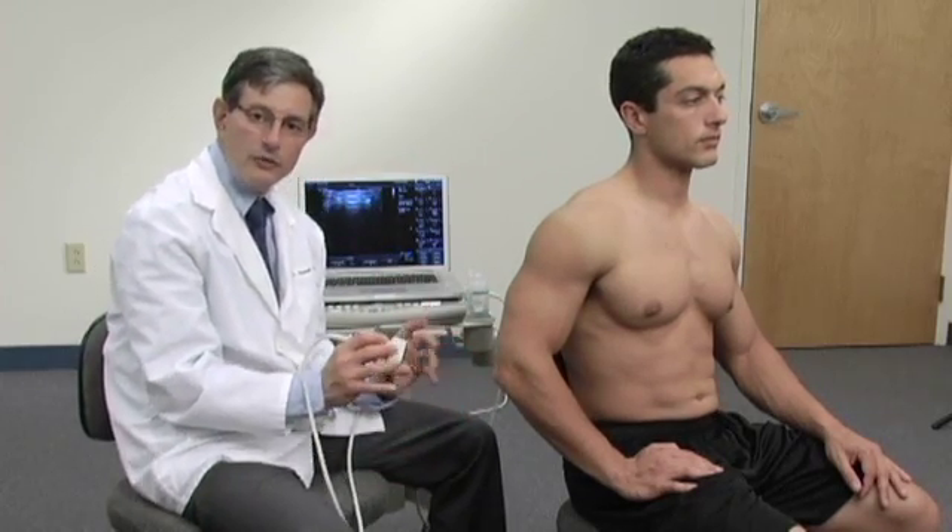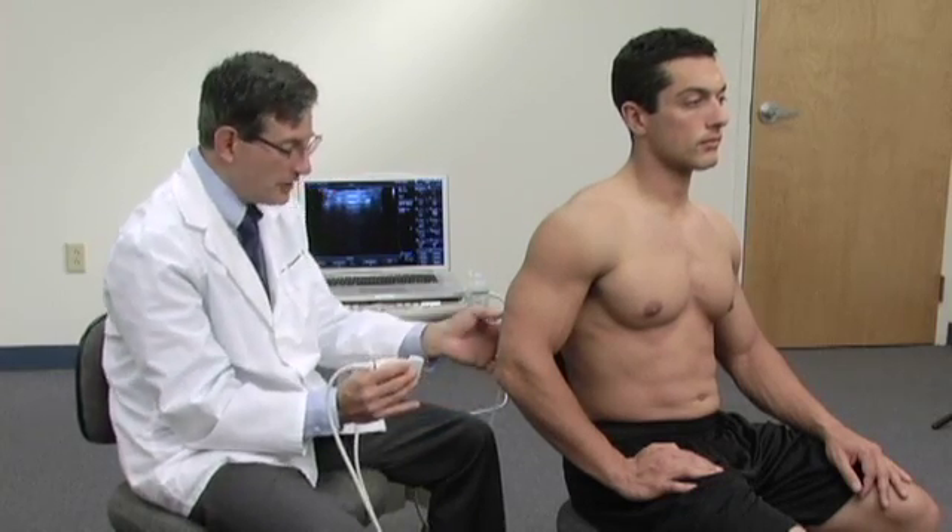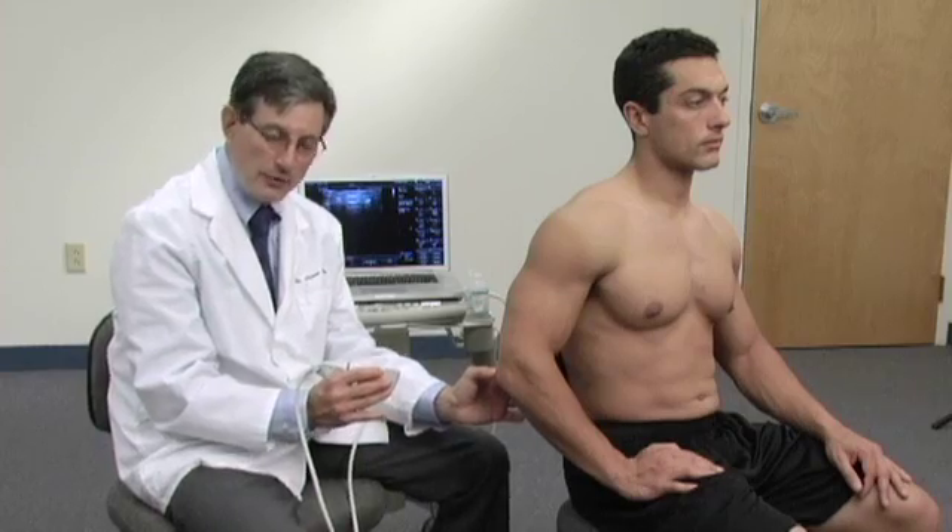Next we're going to look at the posterior aspect of the elbow. Although there are many things we could look at, today we're just going to look at a couple of very important areas. Let's look at the insertion of the triceps tendon into the olecranon.